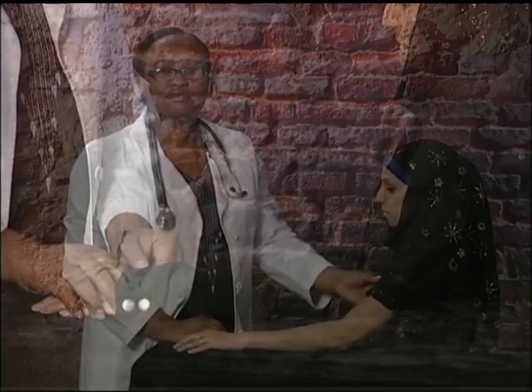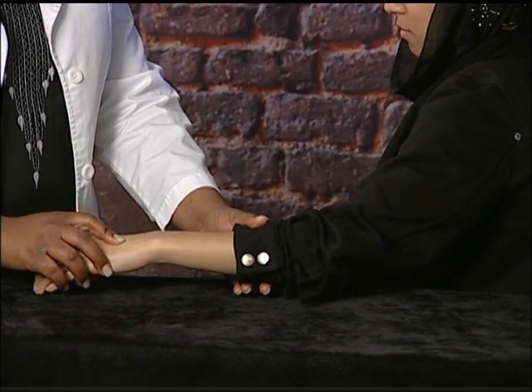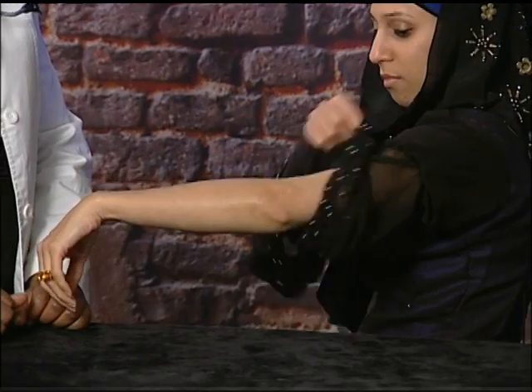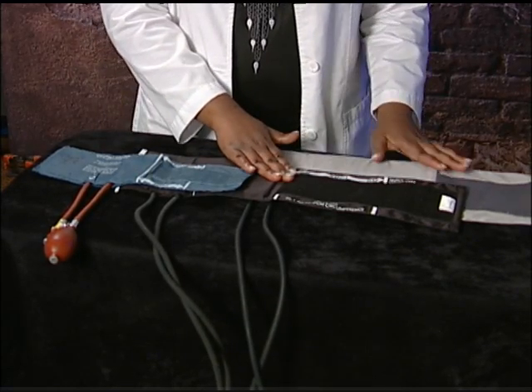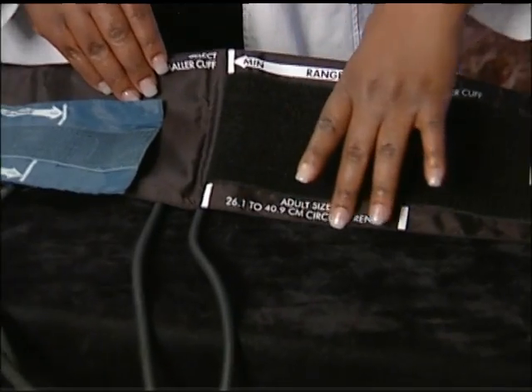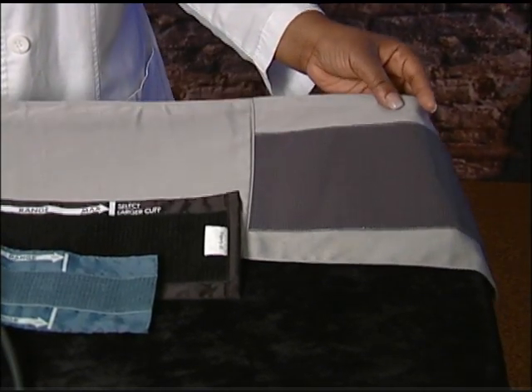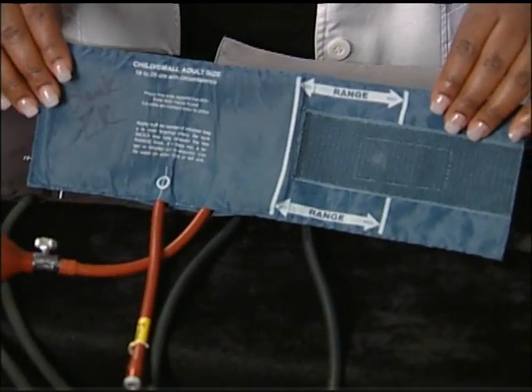Make sure the sleeve is not too tight as that can alter the blood pressure measurement. If the sleeve is bulky or tight, ask the patient to remove the shirt in order to avoid this problem. Next, select the blood pressure cuff that is the correct size for your patient. Labels on the inside of the cuff will show you which size to select. Patients with large arms will require a bigger cuff, and those with smaller arms or children will need a small cuff. Incorrect blood pressure readings can occur if a wrong sized cuff is used.